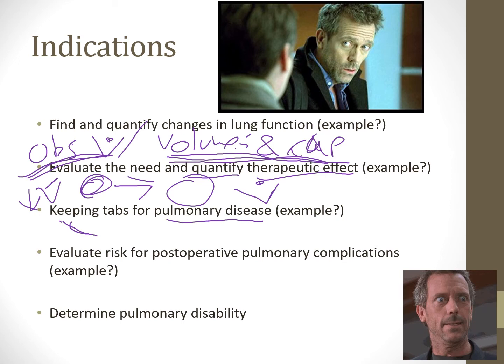We can use them to evaluate the risk for people that are undergoing surgery, so we're looking for post-operative pulmonary complications. One of the biggest issues out there, especially for patients undergoing surgery like gastric bypass, is the possibility for their lung function to decrease severely after the surgery.